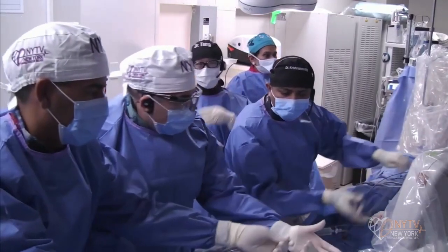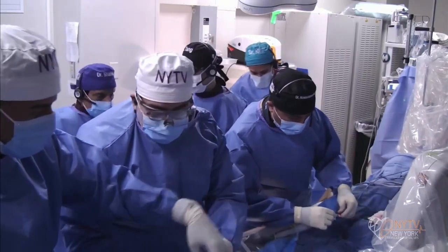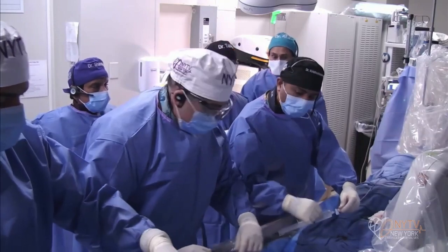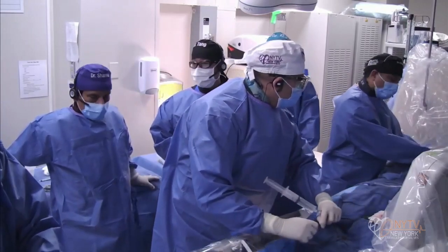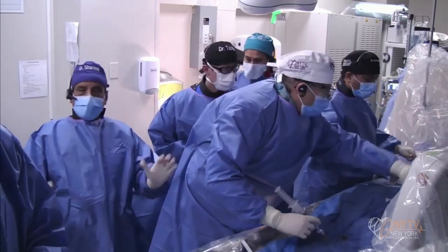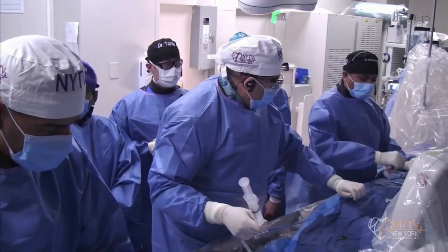The gradient today was valve area less than 1, 0.8, 0.9, and mean gradient of 23. So I'm not sure this patient would have qualified for that trial, but certainly commercially, if you have a tri-leaflet valve, this could be a potential option. And in fact, in Europe, they are doing some of that in AS patients as well, combined.